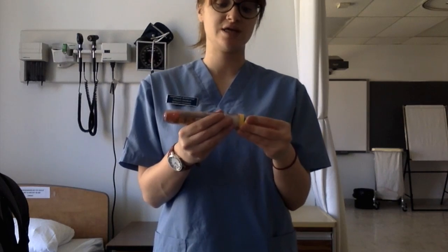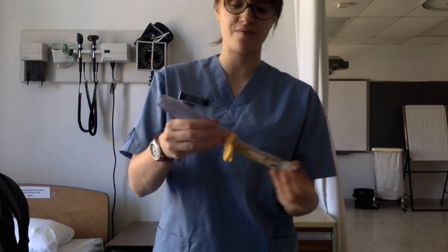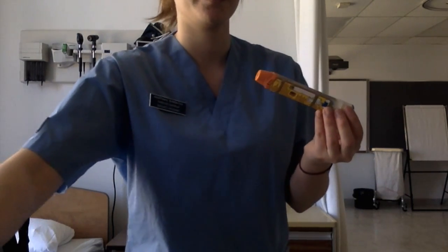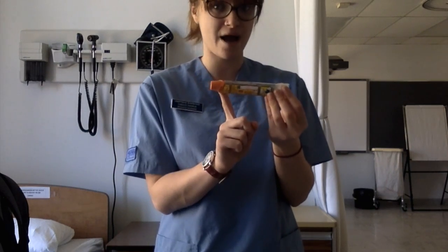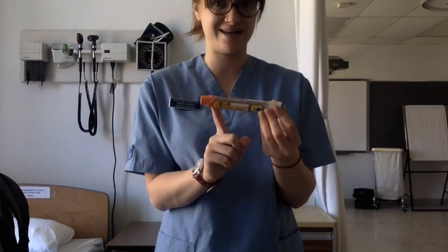The first thing you're going to do is remove the EpiPen from the container. The orange tip here is the one that has the needle. It's covered so that someone administering it doesn't accidentally inject themselves with an epinephrine injection.